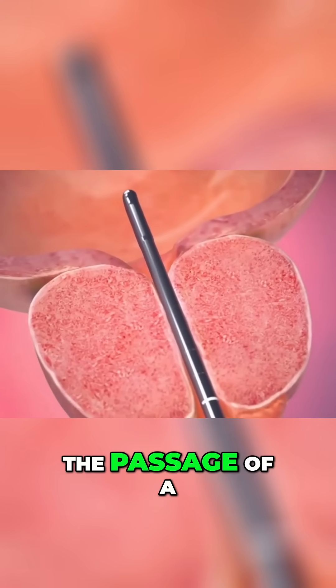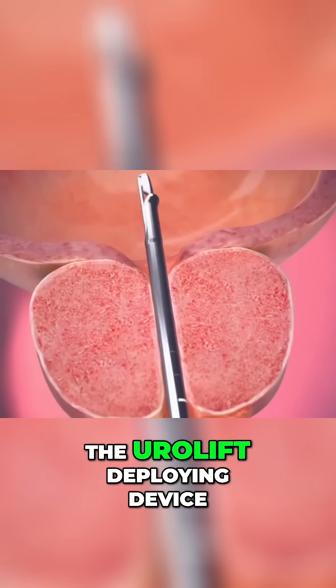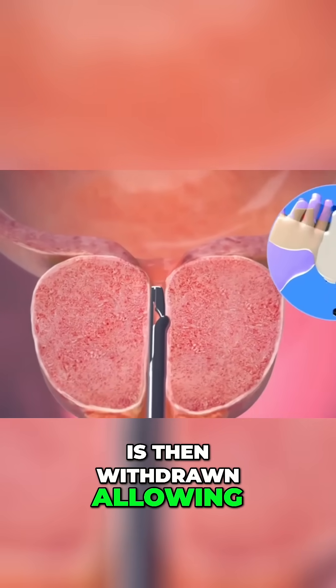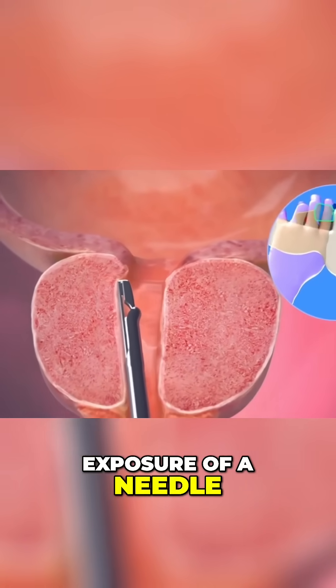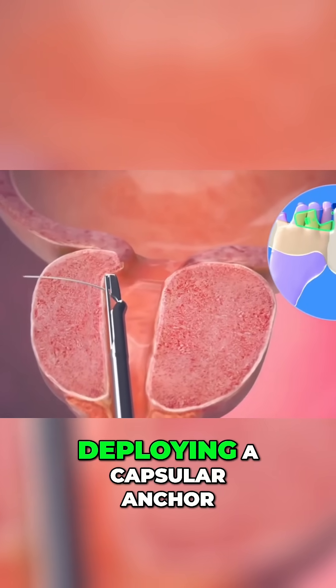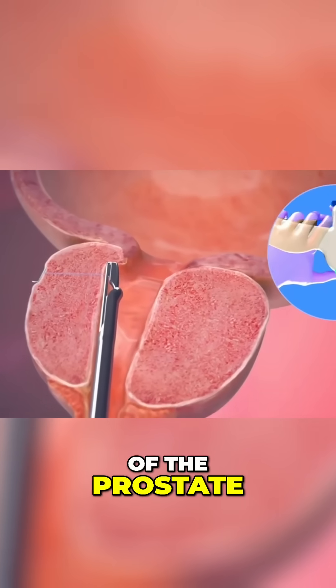The following animation highlights the passage of a cystoscope through the prostate and into the bladder. The Urolift deploying device is then withdrawn, allowing exposure of a needle which is then placed through the prostate, deploying a capsular anchor at the external part of the prostate.